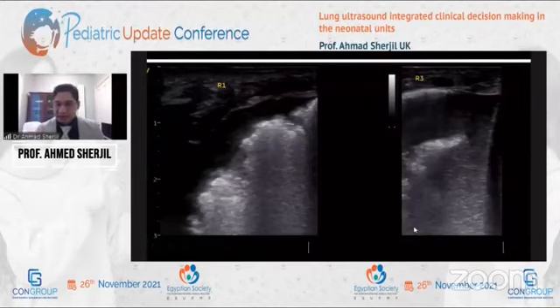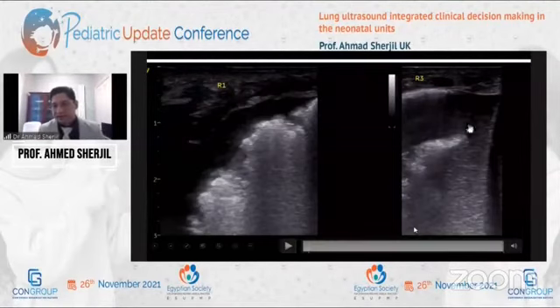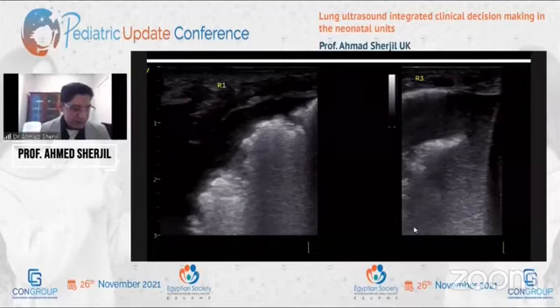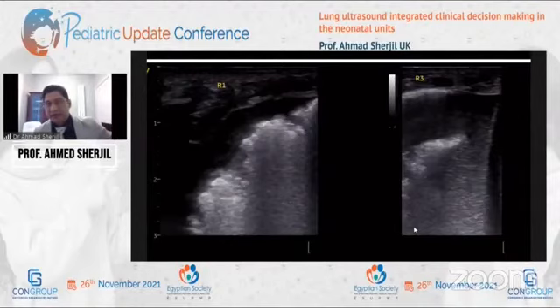So this suggested blood clots. There was a chest drain, so I didn't think all this floating debris could just be blood. Bottom of the differential diagnosis, but could it be lymph from the lymphatic duct that might have gotten damaged when a chest drain was put in?